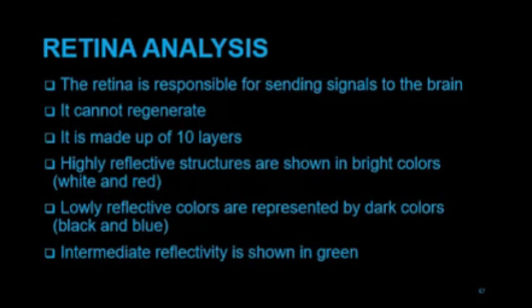Over to retinal analysis. We are done with glaucoma analysis. Remember I told you that OCT is not just for detecting and grading the extent of visual loss in glaucoma. We can also use it to examine the retina and diagnose pathologies in the retina. So we are now over to retina analysis.